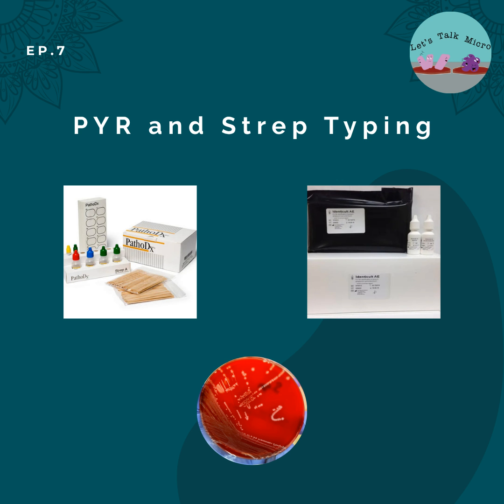Like I mentioned, the kit has the 3 reagents, and then it has 5 different latex bottles: one for A, one for B, one for C, one for F, and one for G. When you're doing the extraction process, with 2 drops of reagent 1, 2 drops of reagent 2, add your colonies, and 4 drops of reagent 3, you can use that to test for all 5. So one suspension or extraction is good enough for you to test for the 5 antigens.